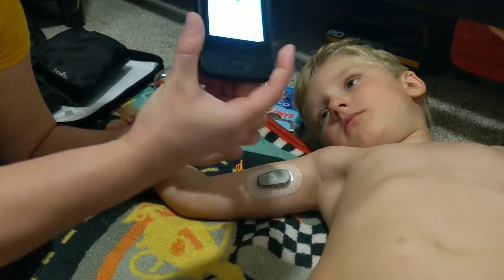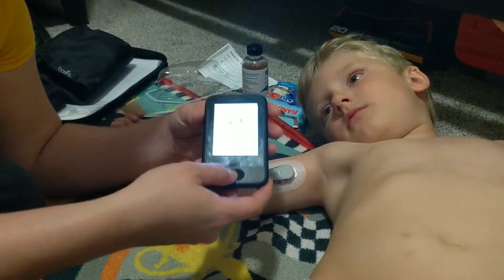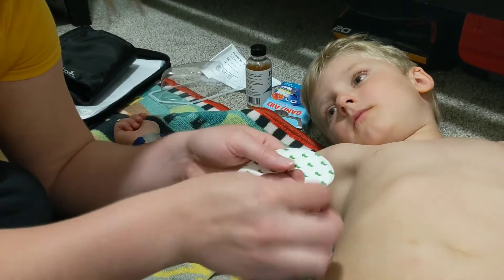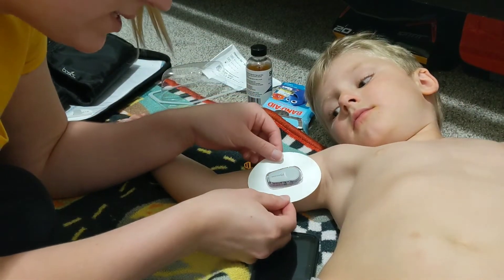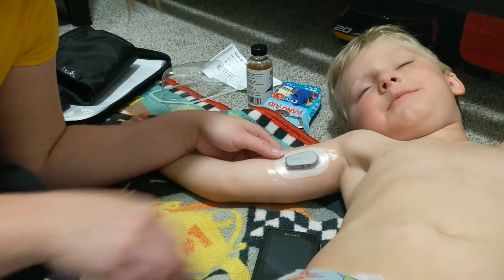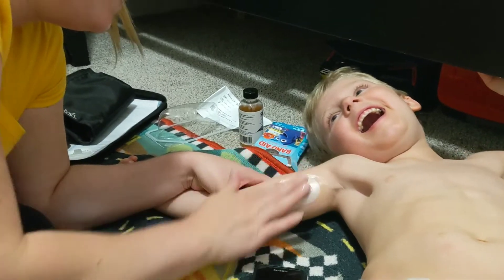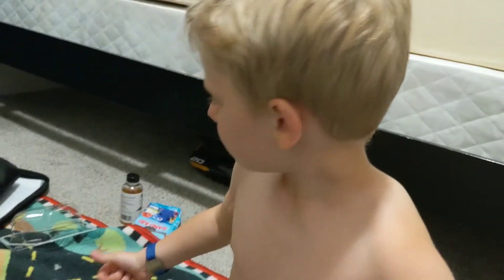The sensor has a two-hour warm-up. The receiver has to stay right next to Riker during warm-up or it will fail. The last thing to do is take one of these adhesive stickers, pull the green arrow part off first — that's the sticky part — and place it down around the sensor. Then pull the little tabs up on the white piece and rub around it three times as well.